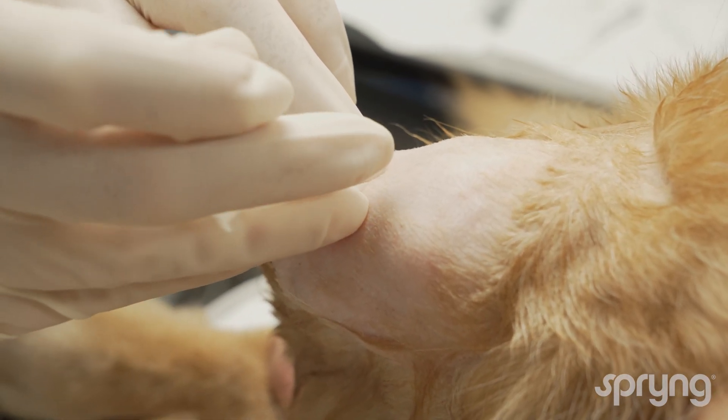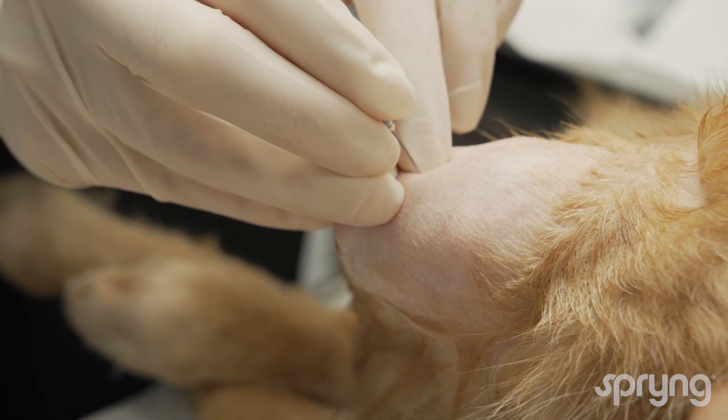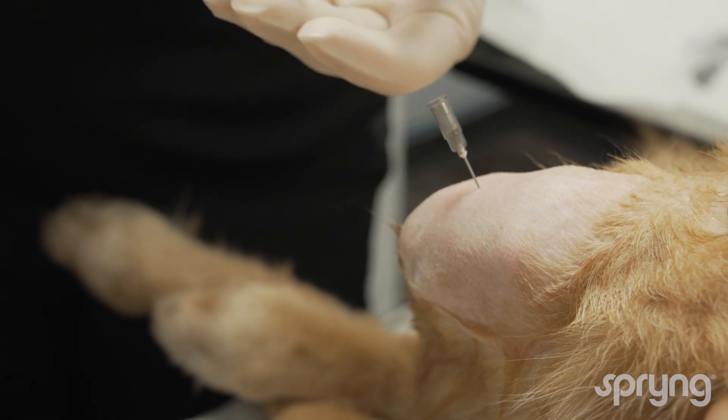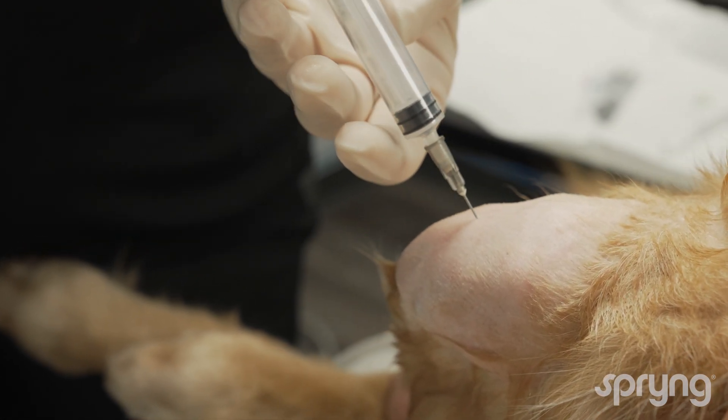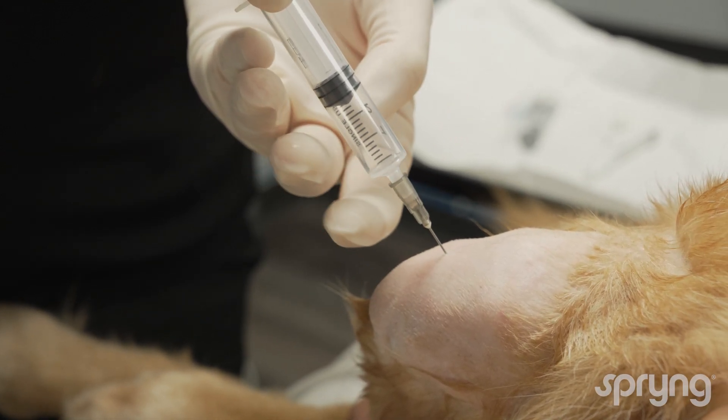Insert the needle just lateral to the patellar tendon, directing the needle parallel to the joint. Advance the needle through the fat pad, but not beyond the joint.